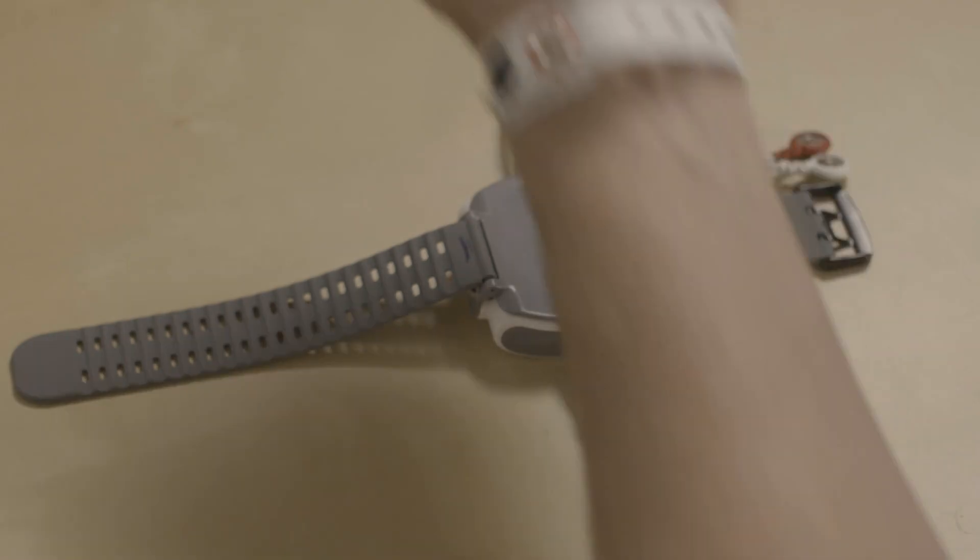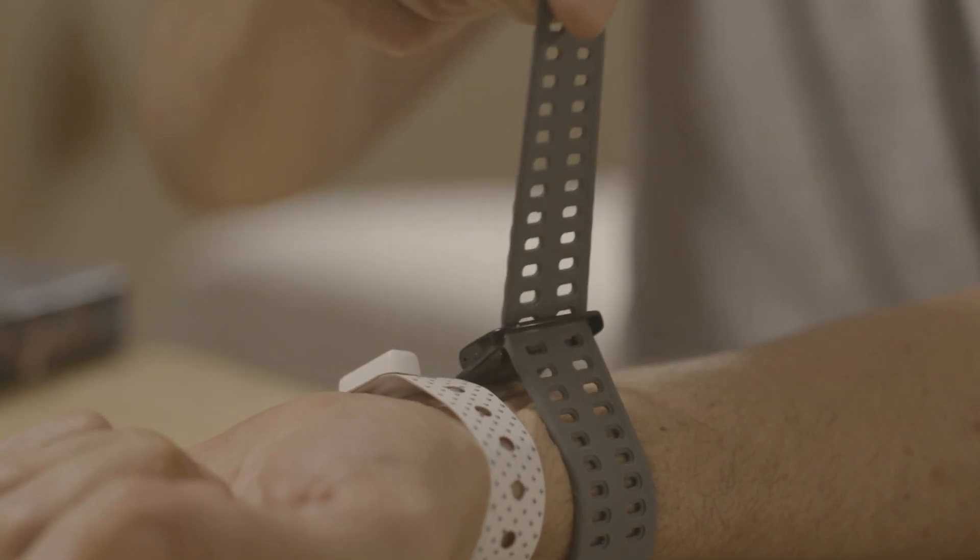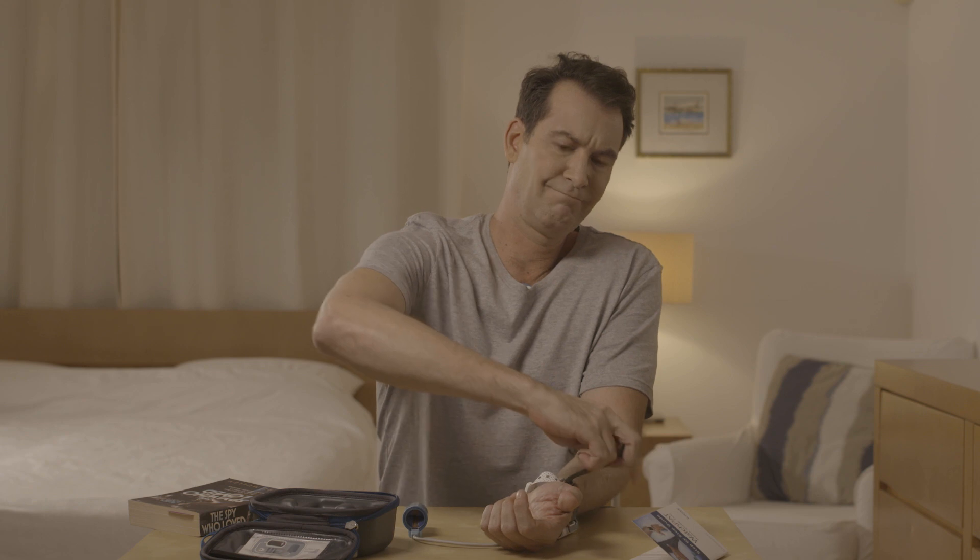You'll be putting the WatchPad on your non-dominant hand. Here you see how a right-handed person puts the device on his left hand. Place the WatchPad on a flat surface. Insert your hand and close the wrist strap, making sure it's snug but not too tight.